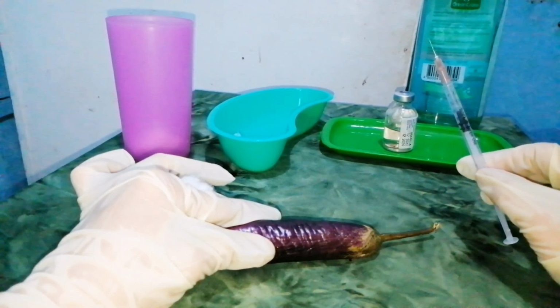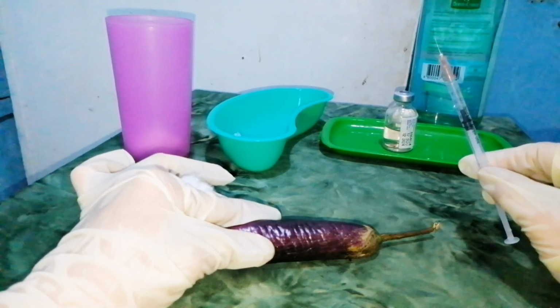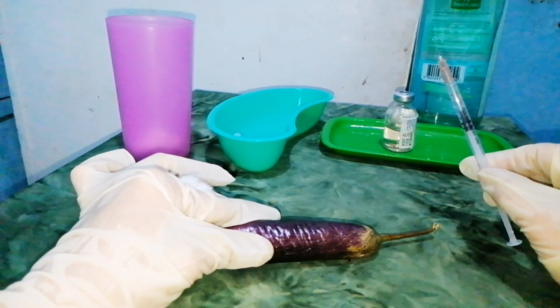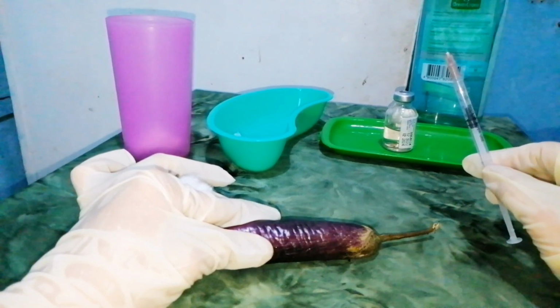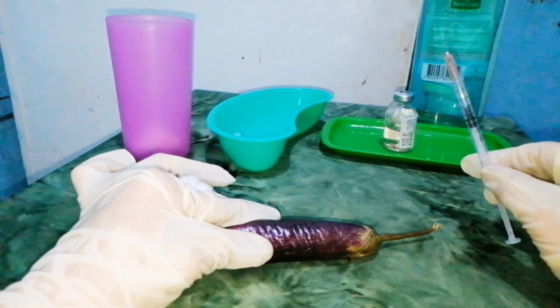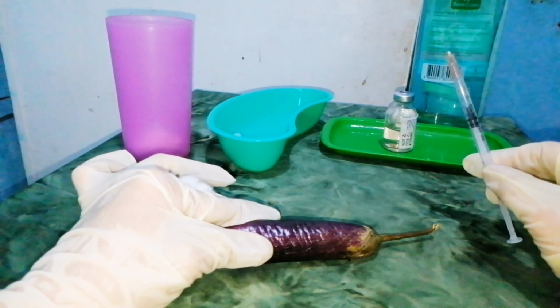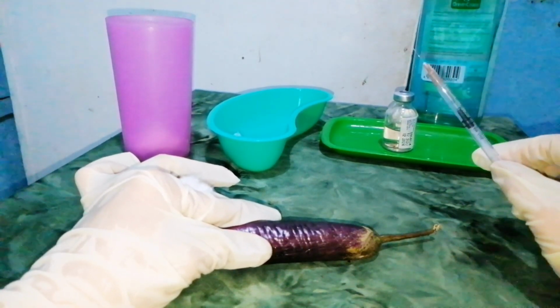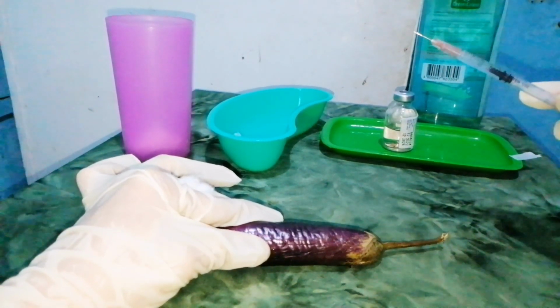Remove the needle cap while waiting for the antiseptic to dry and pull the cap straight off to avoid contaminating the needle with the outside edge of the cap. Grasp the syringe in your dominant hand by holding it between your thumb and your fingers. Now, inject the medication by holding the syringe steady and depressing the plunger with a slow, even pressure.